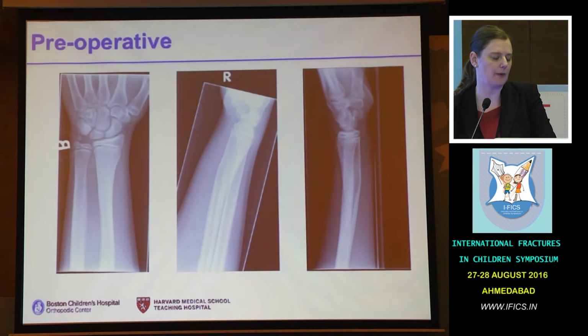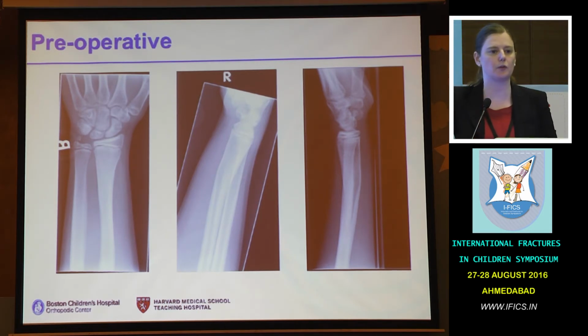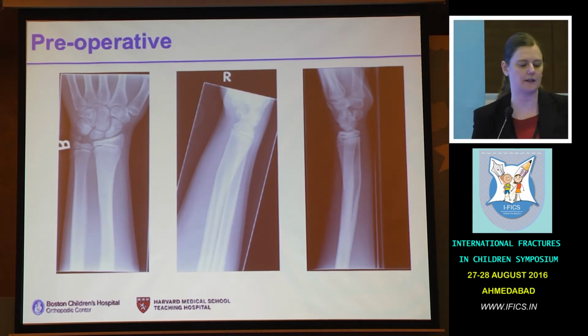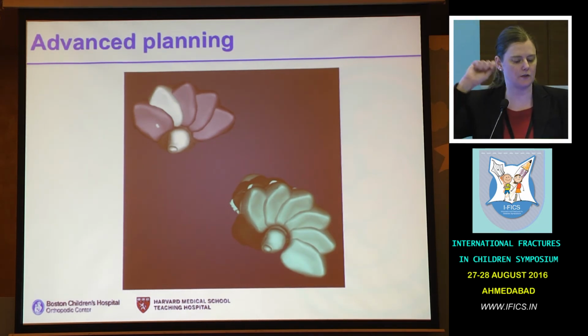So then I had another patient who had a distal radial malunion, and he had a problem that every time he supinated, his wrist clunked and he had wrist pain. And this was, again, a very subtle finding, and I used the same technology in order to plan his. If you look at the green, that's after the osteotomy. You can see that the distal radioulnar joint is congruent and the radius moves around.